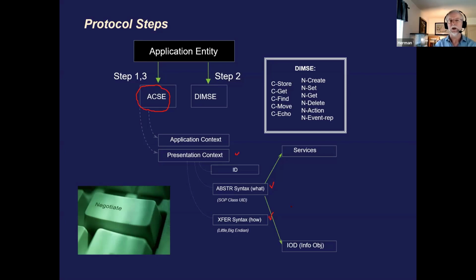This is kind of irrelevant here, because the transfer syntax is really more important when you exchange images, like when we want to compress them or send them with a different encoding.